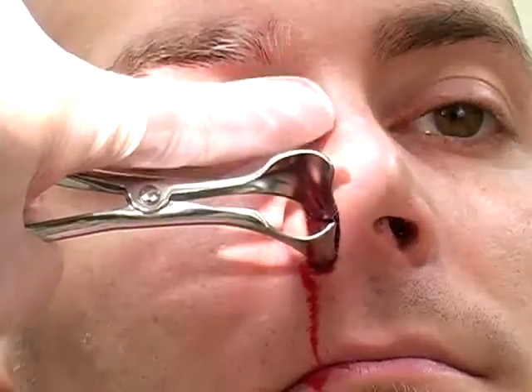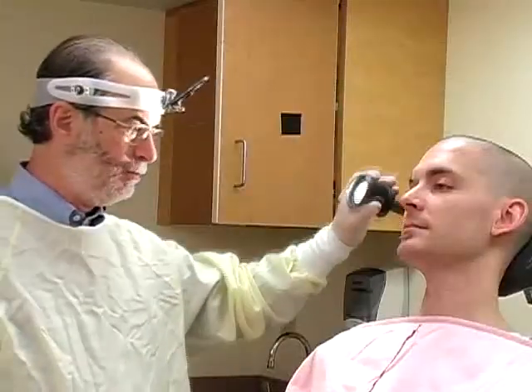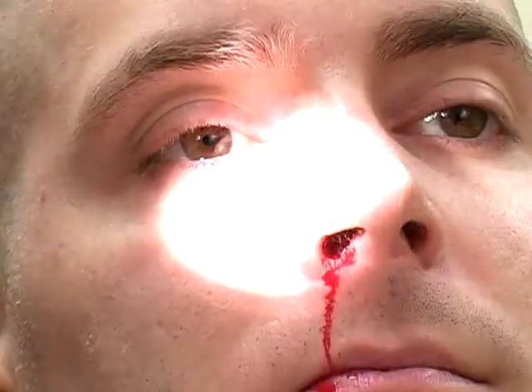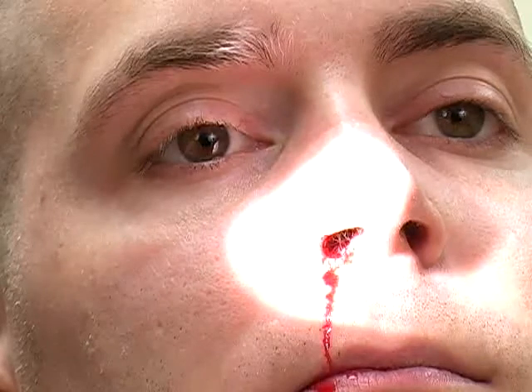Proper visualization of the source of bleeding is essential for management. Use a headlamp with an adjustable narrow beam to provide for optimal lighting. In this video, the physician uses a head mirror, which provides excellent illumination of the field.